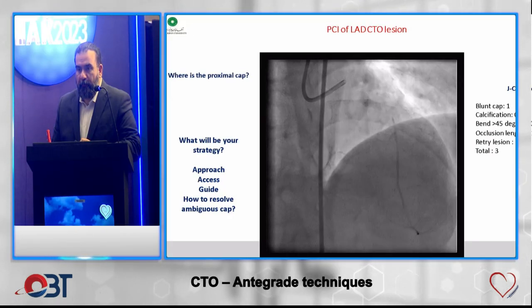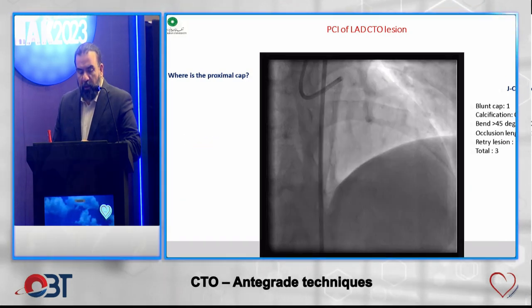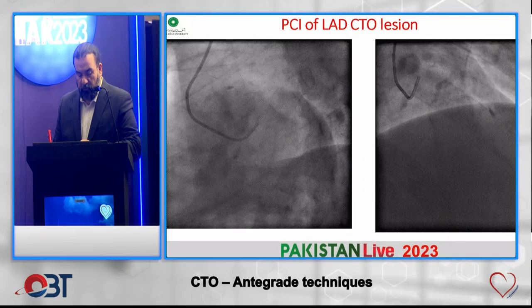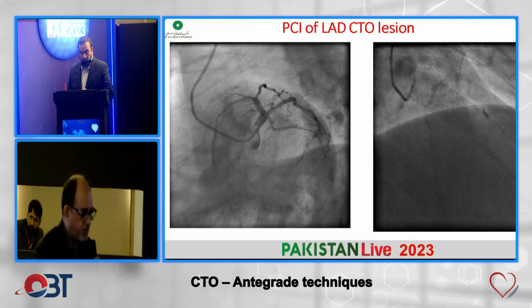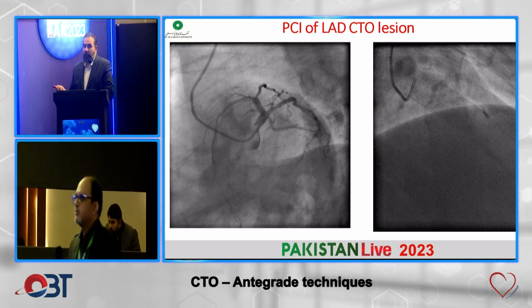Visible lag rahi hai aur itni blunt nahi lag rahi, thodi tapered si lag rahi hai. I don't know whether I'm seeing it wrong or. Mujhe, you know, nazar nahi aayi thi, but let's go back to the spider view. Dr. Nader, you are right that there might be suspicion ke wahan pe proximal cap ho septal ke saath, jaise Dr. Tayyab bhi keh rahe hain, but you can't be 100% sure. To yahan pe kahan pe aapko nazar aaya mujhe?